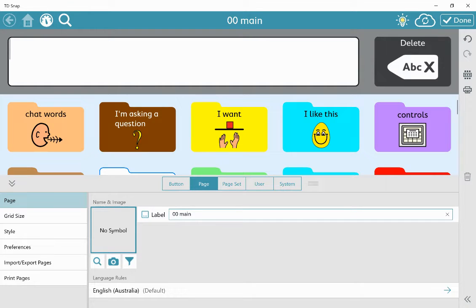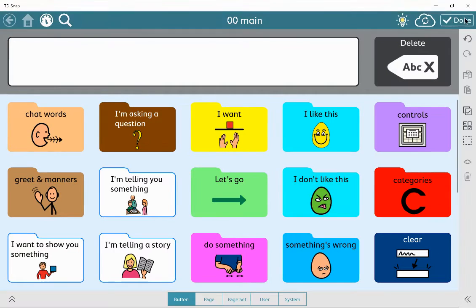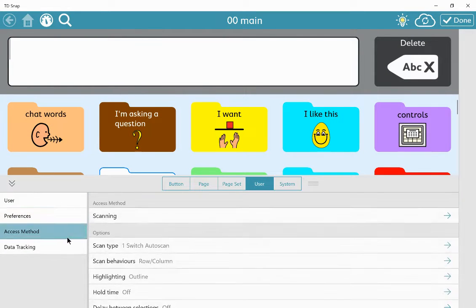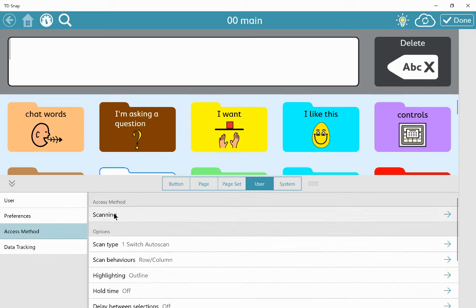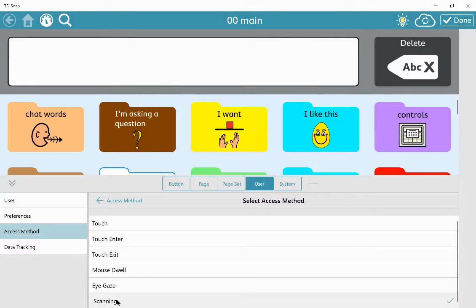To set up auditory switch scanning in Snap, you'll need to first go to the settings, then to user and to access method menu. You can change the access method from touch to scanning.